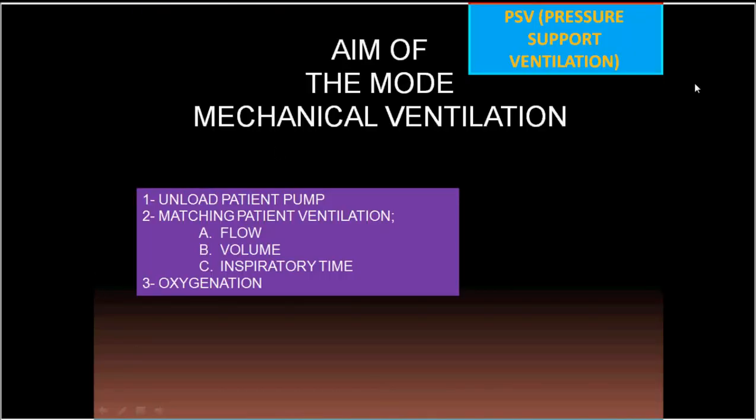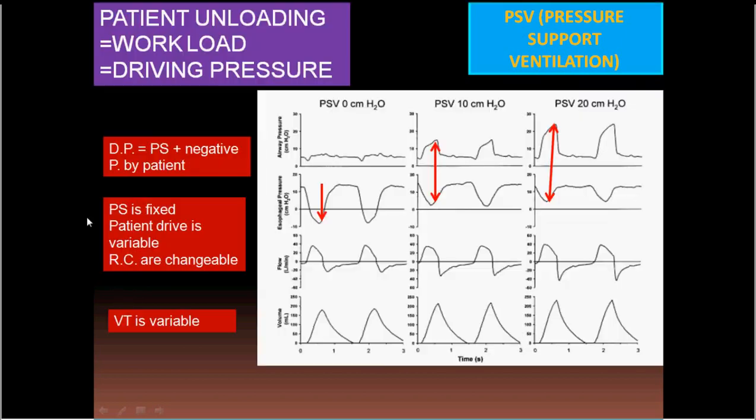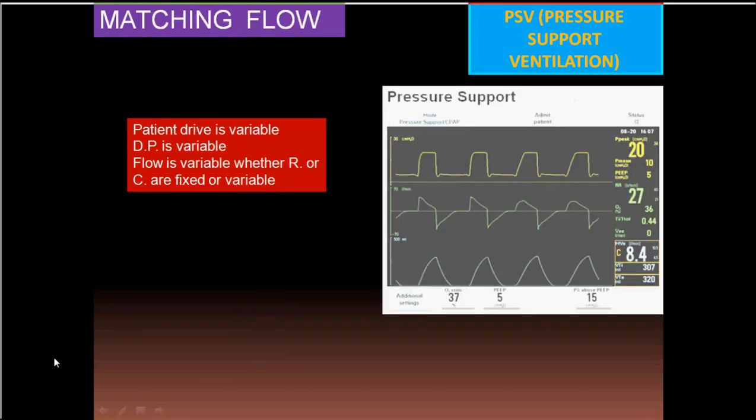So what is the reaction of the ventilator in pressure support with the patient regarding volume, flow, and driving pressure? I've mentioned before that there is a share of the driving pressure between the ventilator and the patient, and this should be considered. It is considered while you are weaning the patients.